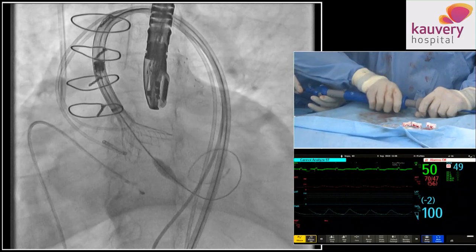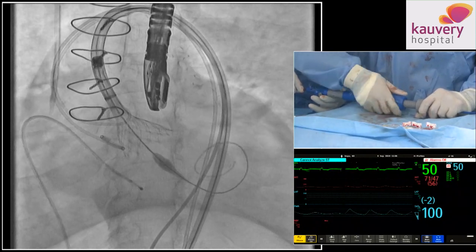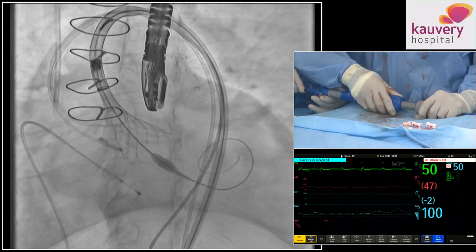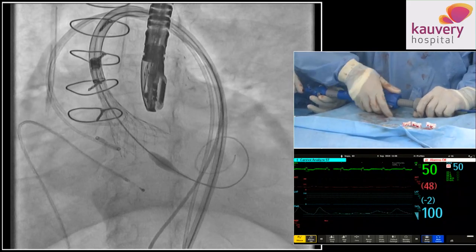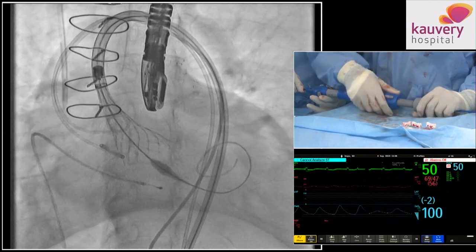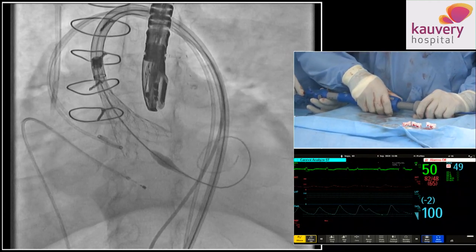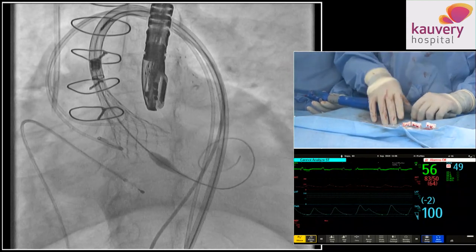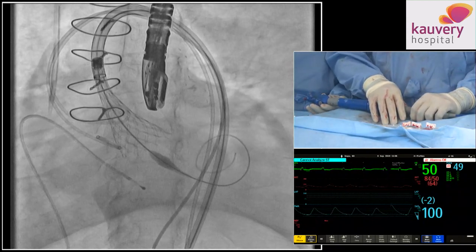I'll keep that in position. Okay, just go push it further now. No, I'm fine, don't push here. Keep releasing once the valve opens up. Pressures, please. Coming up. Now this looks better. Once the valve opens up to 60%, pressures are coming up.